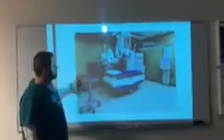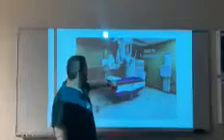This right here is what a fluoroscopy really looks like. You can see that this is the fluoroscopy table. This is the overhead that's used for X-rays, which you can use for the scout film before you start the X-rays of the fluoroscopy. This over here comes out over the patient with lead strips to protect the radiographer. And this right here is the viewing monitor, so that while the radiologist is taking the images, he or she can look at what they're trying to find.